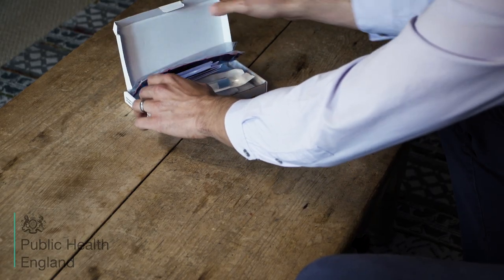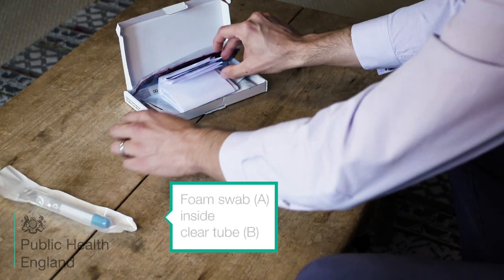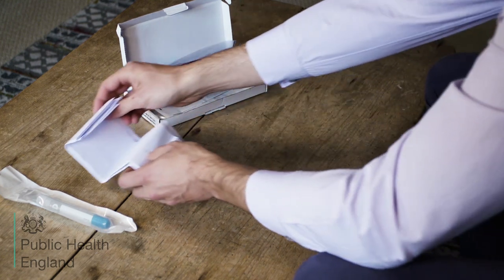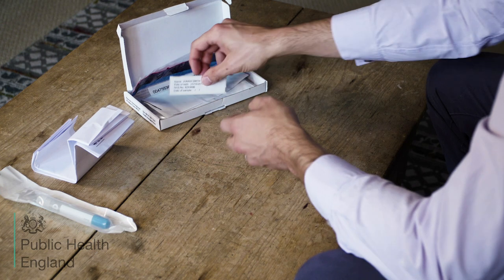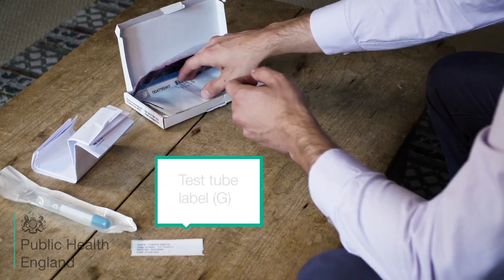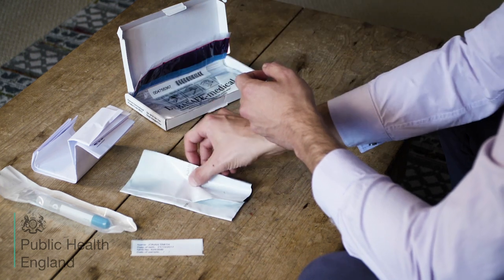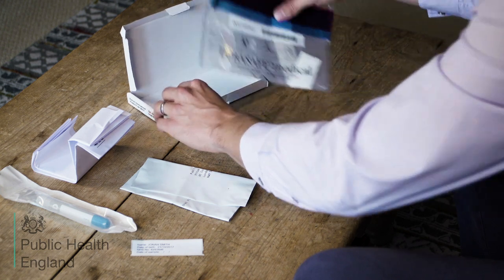In the swab test kit you should have the following: a foam swab labelled A, inside a clear tube labelled B. The cardboard box contains a request form labelled E, and a label for the test tube labelled G. A prepaid plastic envelope labelled F, and a self-adhesive plastic bag labelled C.